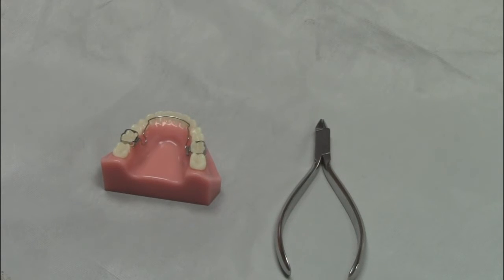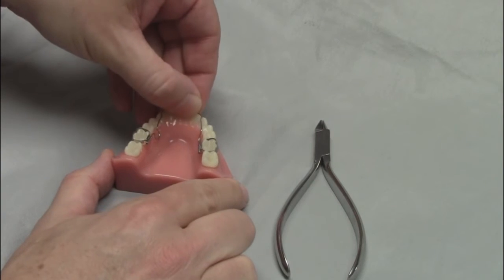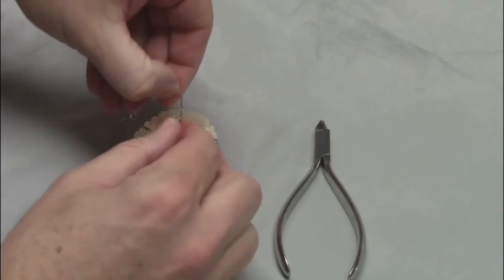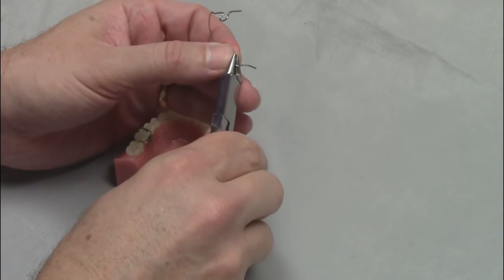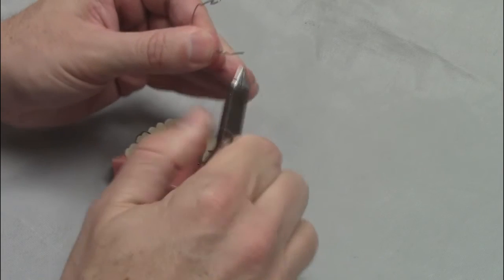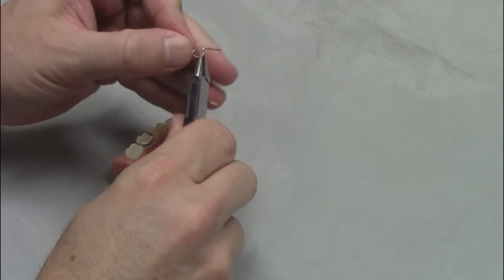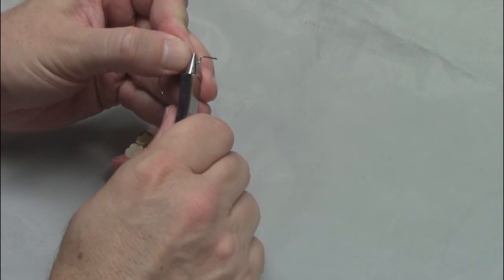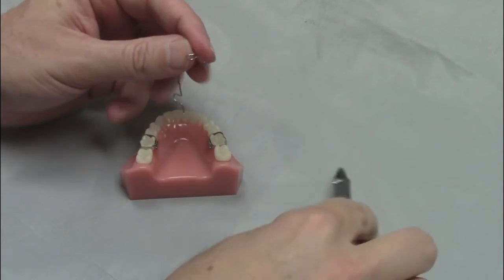When you receive the BWS back from us, it will be ready for you to insert. The anterior wire will be bent to an ideal arch form. In order to activate the appliance, you'll need to remove it from the tubes on the molar bands. A flat-on-round instrument is used to open up the loop on each side. At the first appointment, you should activate the loop one millimeter. You will see the patient every three to four weeks to activate it an additional one to two millimeters each time until you have moved the teeth into the desired position.